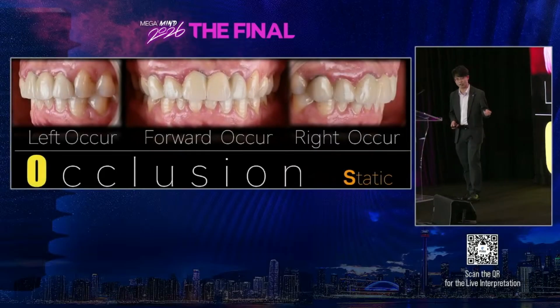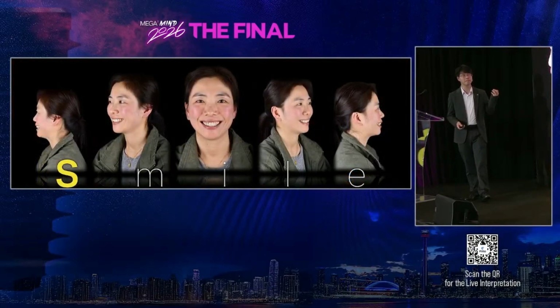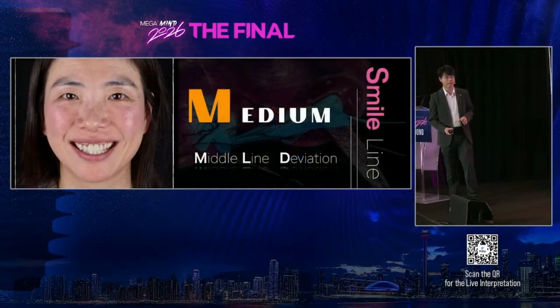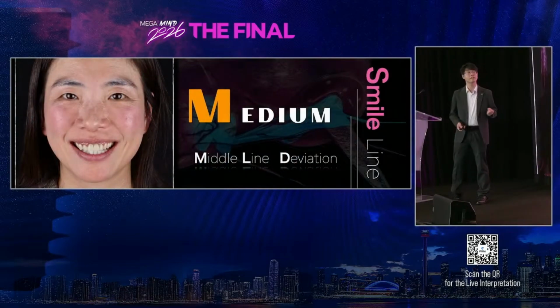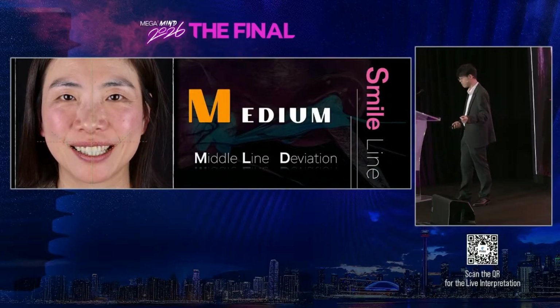And the static occlusion is stable on forward, right, and left side. And this is the facial smile of the patient. Every anterior prosthetic case we will begin from the face, not just the teeth. And also we need to analyze the smile line of the patient. This patient has a medium smile line and the midline has a little deviation.